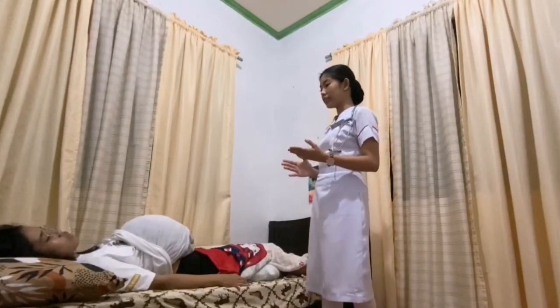So it has been a minute, and the fetal heart rate is 140 beats per minute, which is normal naman po, or in the range of 120 to 160 beats per minute. After that is to make the patient comfortable and provide comfort measures.